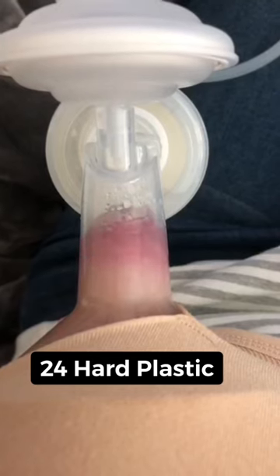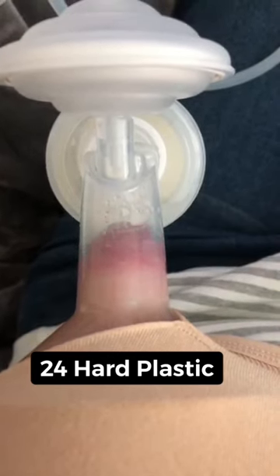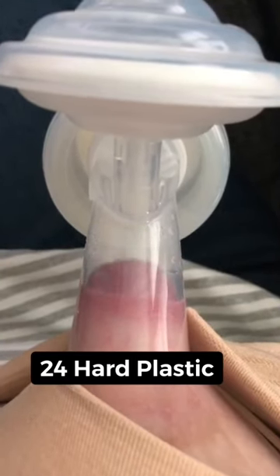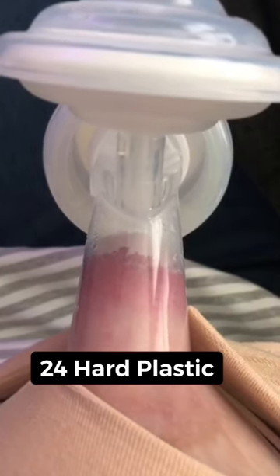She definitely has elastic tissue, but the biggest red flag was that she told me she was uncomfortable and was in pain. So I said, why don't we go ahead and try switching to silicone flanges right away. The size doesn't look so off — maybe it's a little on the bigger side, but nothing too extreme.